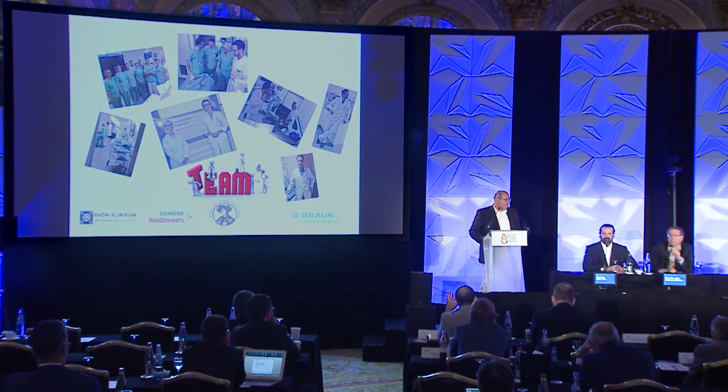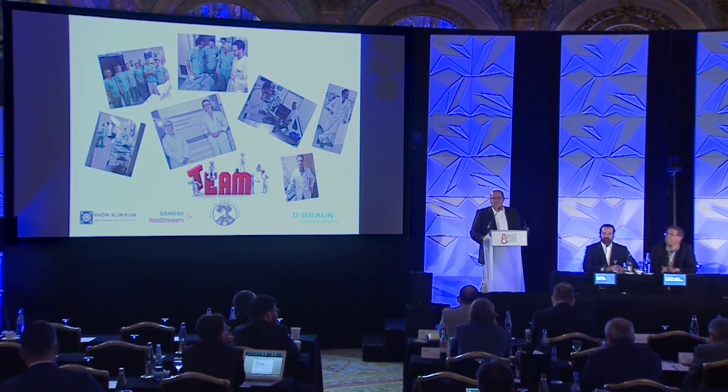Very last and short comment or question, Naveen, please. Yeah, so that was really great. I had 2 questions just to clarify. One was, did you titrate the Impella to achieve that 0.44 liter per minute increase? I just want you to clarify how much support, or if there's a dose response, what's the level of support? We increased it by 3 steps, let's say from 5 to 8, and then decreased it until the MAP was at its baseline levels. So we went up above the original MAP and then dropped it again. This was most of the time just one step ahead, and we ended up with 0.44.